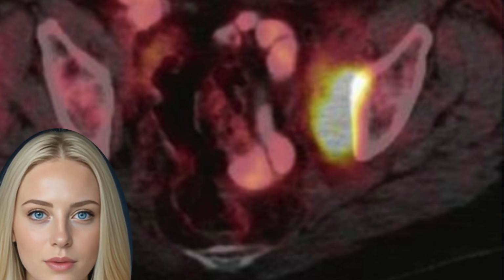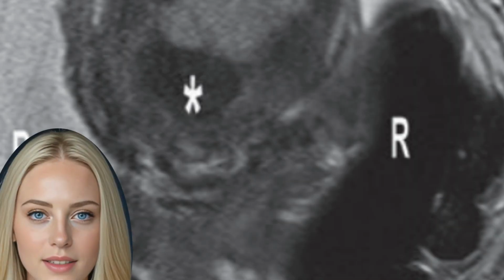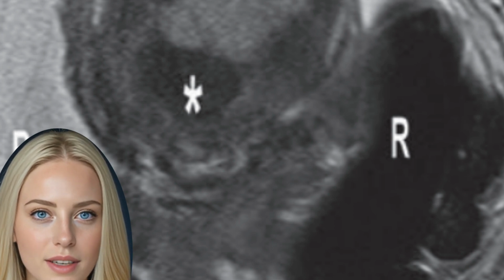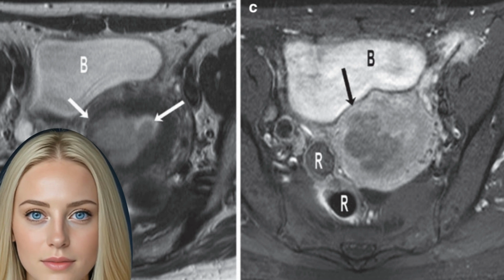High cellularity and cell membrane integrity restrict water mobility and therefore diffusion, as in tumors. During MR performance, diffusion sensitivity can easily be varied by changing the B value used during image acquisition. For gynecologic malignancies, B values up to 800 to 1000 are recommended for local tumor staging and the evaluation of lymph node affection. Quantitative analysis of diffusion may be performed by obtaining and mapping apparent diffusion coefficient (ADC) values.